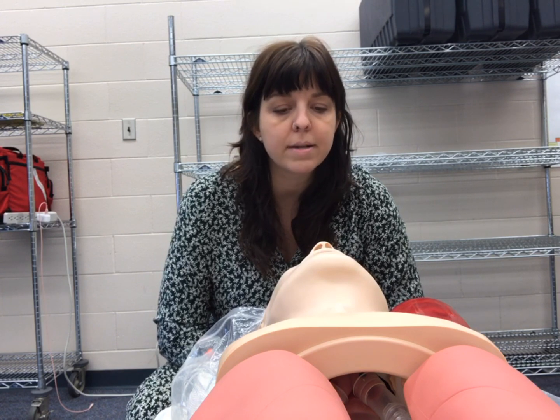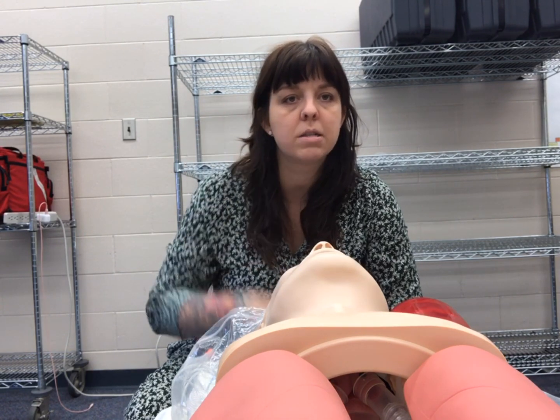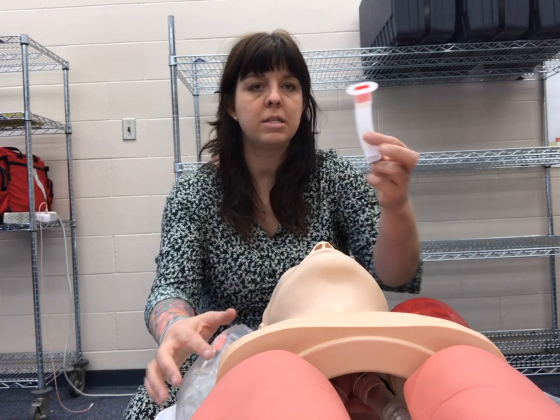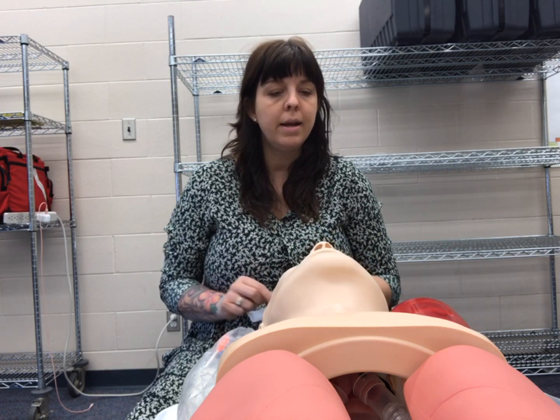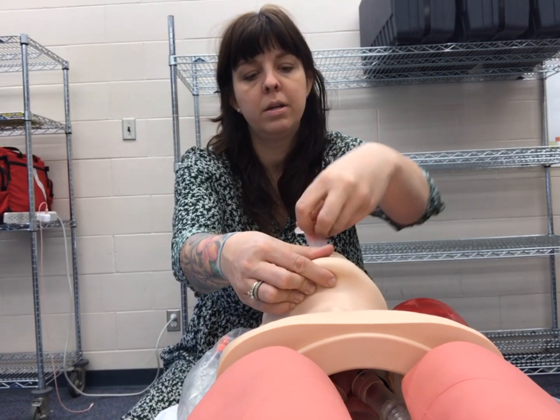There are indications for BLS airways, so I need to figure out which one. I check blink reflex — run your finger along the eyelid to see if the eyelashes flicker — and he has no gag reflex either. That means I'm going to take an OPA, size it from the corner of the mouth to the earlobe, or from the middle of the mouth to the angle of the jaw. Insert it upside down, twist it around the tongue — the flange should rest against the lips or teeth.